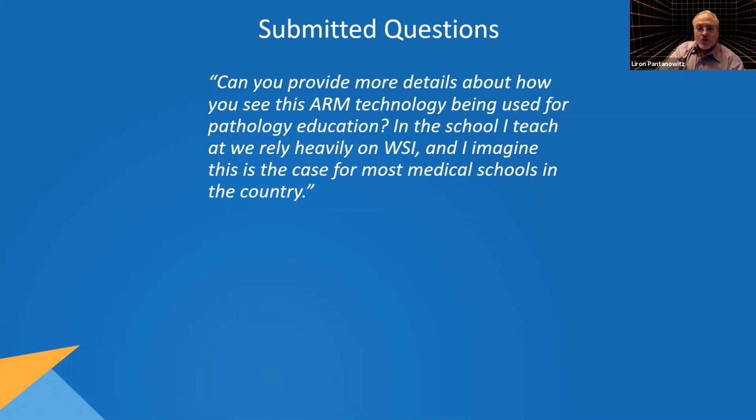So in other words, what you could do is look at the slide, but if the person cannot find the plasma cells or the eosinophils, then you turn on real-time annotation and it points out, look, yeah, the eosinophils. Oh, fantastic. So you can help learners with microscopes wherever they are. I haven't done this personally, but I certainly see that augmented reality microscopy can do that to assist with education. Yeah, I agree. I think both can.